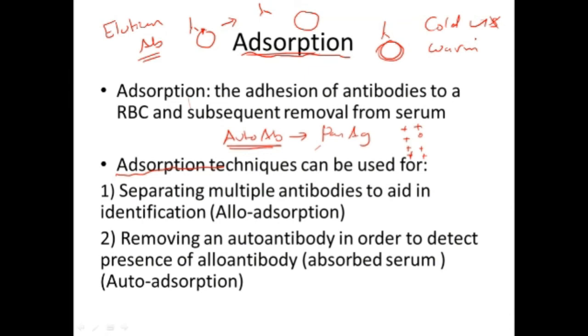اوكي، اللي مو بيسبب لي مشاكل كبيرة مرة هو اللو antibody. اوكي، فأنا لازم إذا كان عندي بيشنت عنده اللو antibody وأوتو antibody، أنا ما أعرف طبعا، لأن الأوتو زي ما قلنا تذكرون شو تسوي ماسك. So it masks اللو antibody. So I have to get rid of these auto antibody, or inactivate them, in order to detect اللو antibody. طيب، one method، أحد الميثودز المستخدمة، the most common or very important method is the adsorption technique. Is to use the adsorption technique, and we will discuss it now, inshallah.